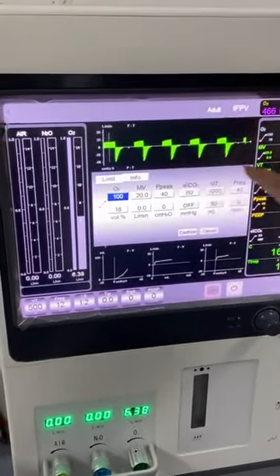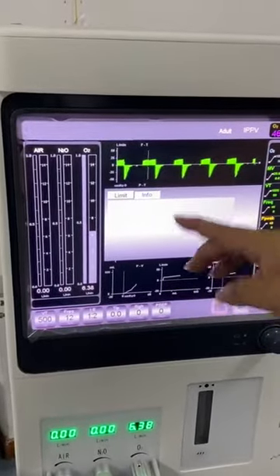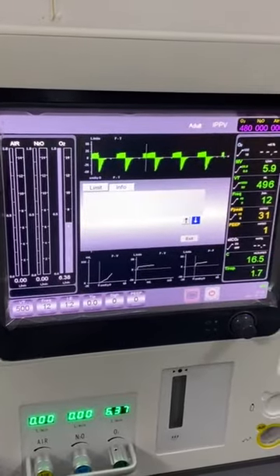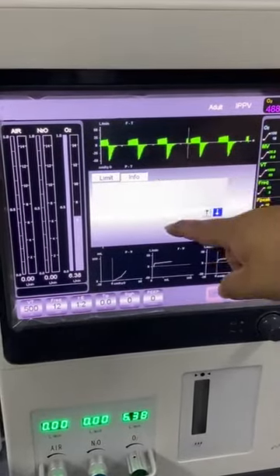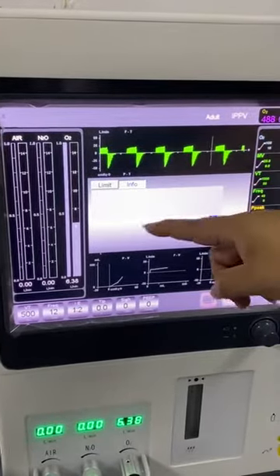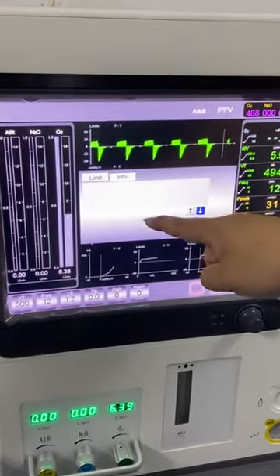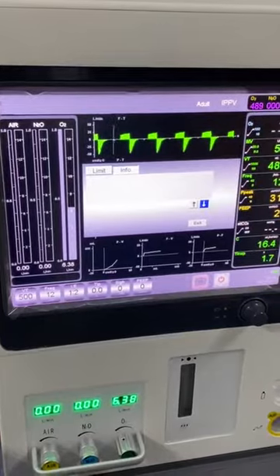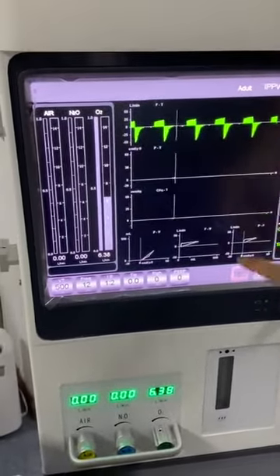And we can see the second column. The second column is for the alarm info. You can see now it's empty. It means the machine has not met any alarms. But for example, after half a year or 1 year, once the engineers go to the hospital to do maintenance for the machine, they can check the alarm info here, so they will know what has happened to the machine before, because here we show all of the history alarms with the time. So the engineers will know what has happened, and they will know how to maintain the machine very well and recover the machine.